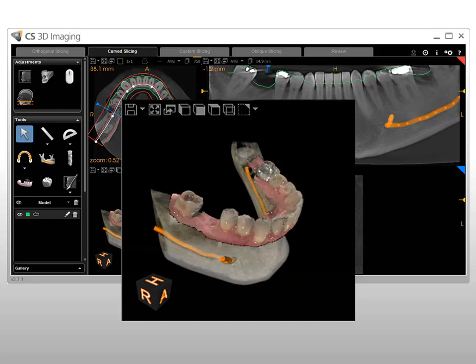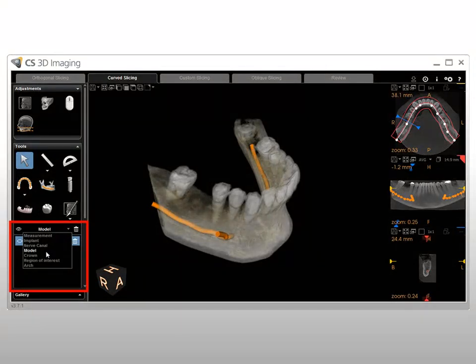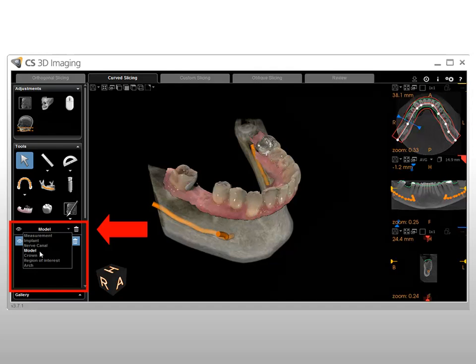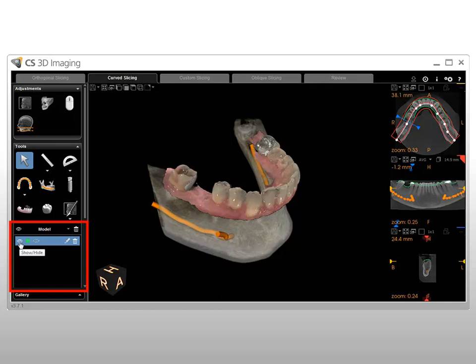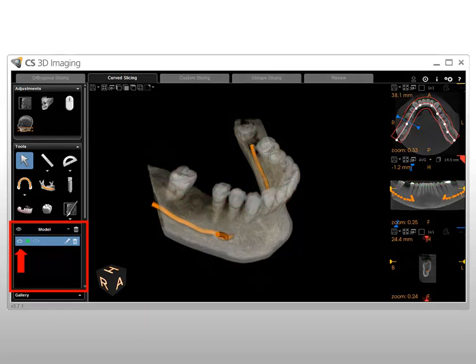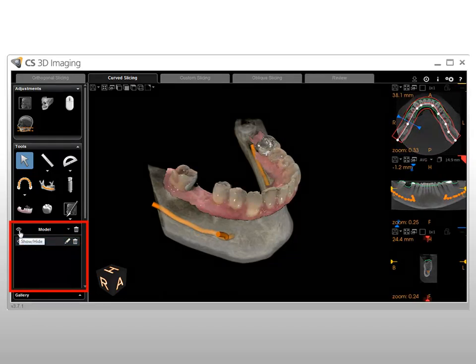Check that the alignment has been performed correctly by comparing the patient's teeth with the model. To show or hide a model, in the Object Management panel of the Curve Slicing tab tools, click the drop-down arrow and select Model. In the list of models, click the open eye to hide a model, or click the closed eye to show a model. To show or hide all models in the volume, click the eye repeatedly.